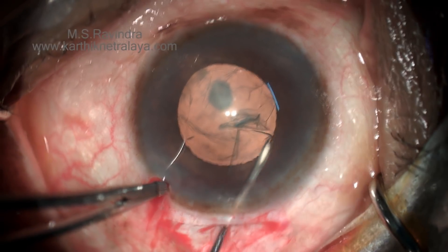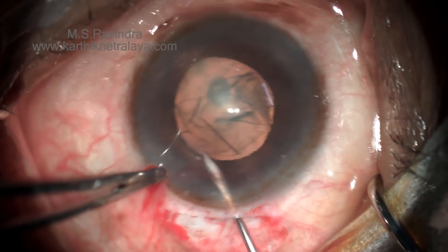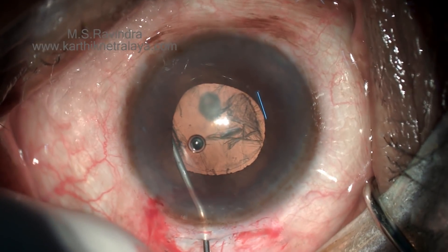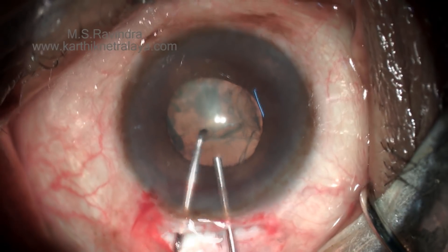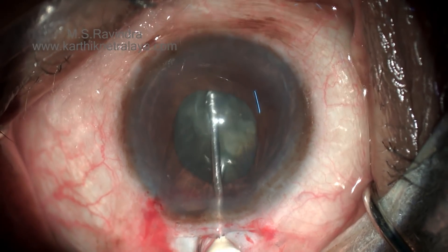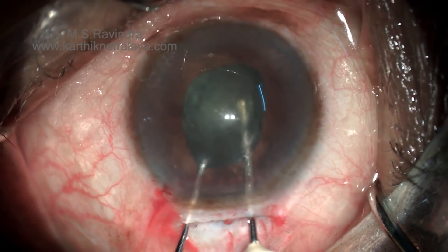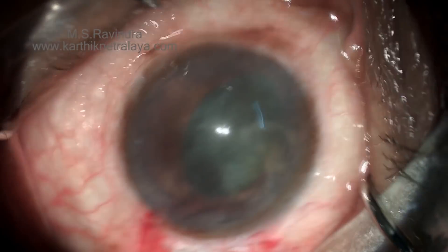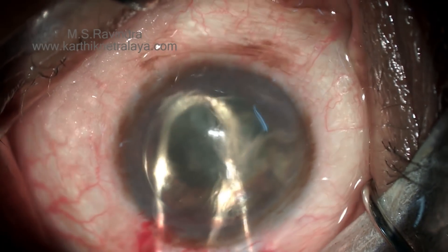In another case with a posterior subcapsular cataract and a moderately dilated — not very large — pupil, I perform hydrodissection in every such case. It really helps in saving the posterior capsule, contrary to usual teaching. The first thing I do is rotate the nucleus and epinucleus mass, which is again removed in two pieces.